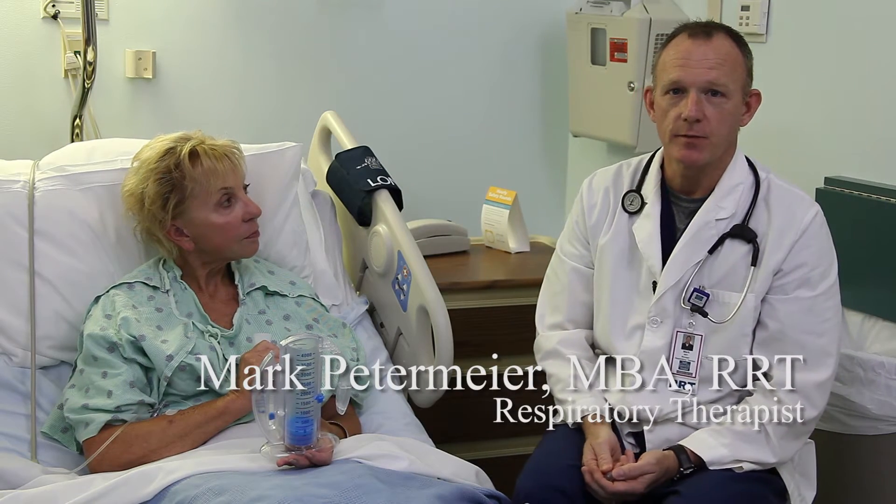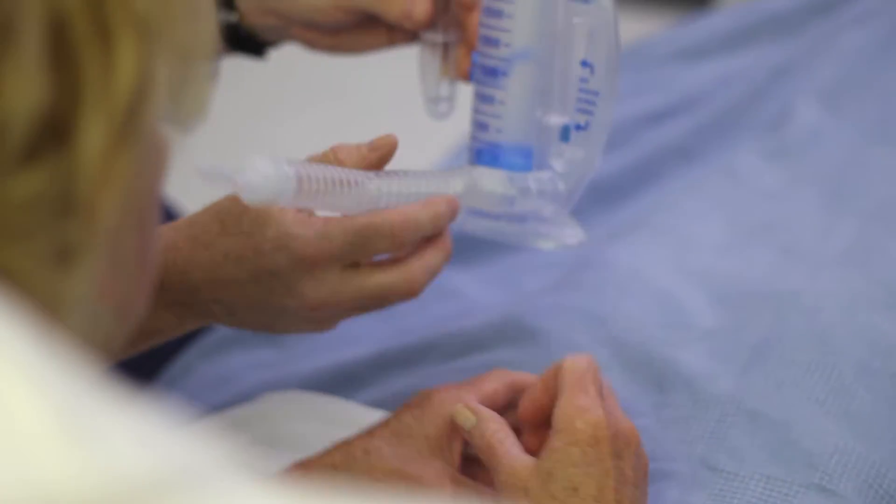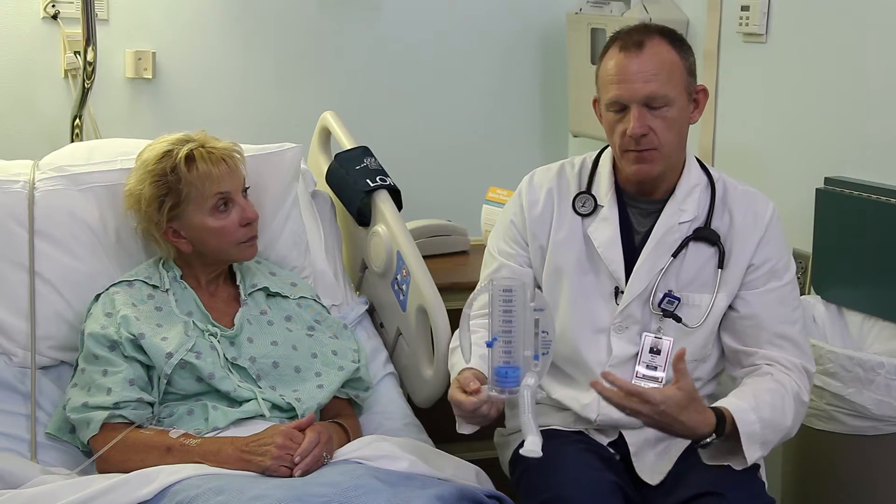My name is Mark Petermeyer. I'm a respiratory therapist at North Kansas City Hospital. I'm here with Kathy and she's going to help me demonstrate the proper technique for an incentive spirometer. An incentive spirometer is a device that we use to expand the lungs to help prevent pneumonia after surgeries.